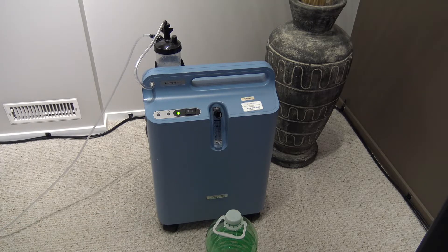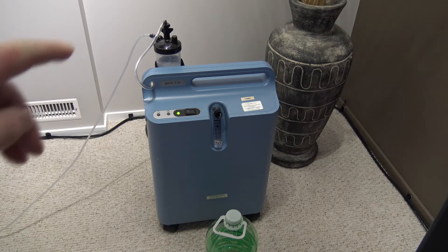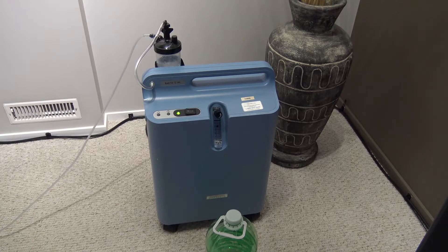Once a week I clean it out, the humidifier on top, that little thing up there — keep it cleaned up once a week. And every day I have to check the levels in there to make sure there's enough water for the humidity.